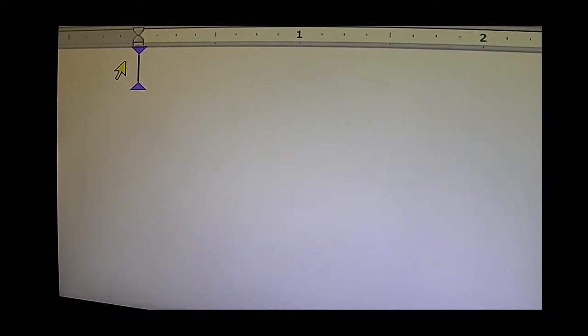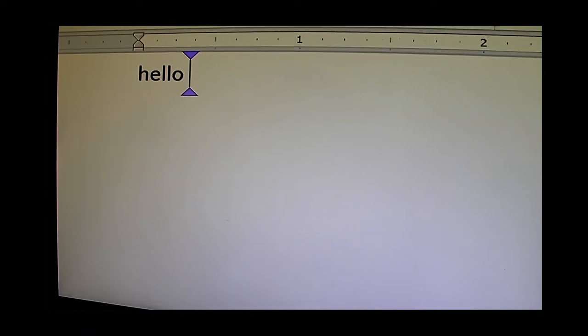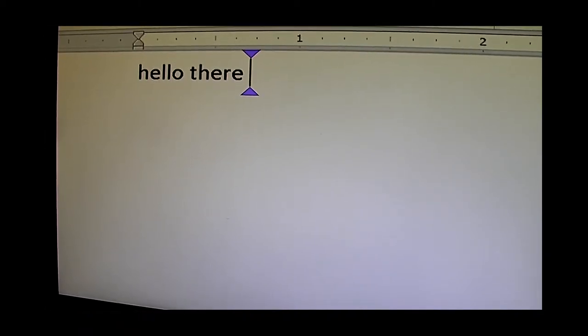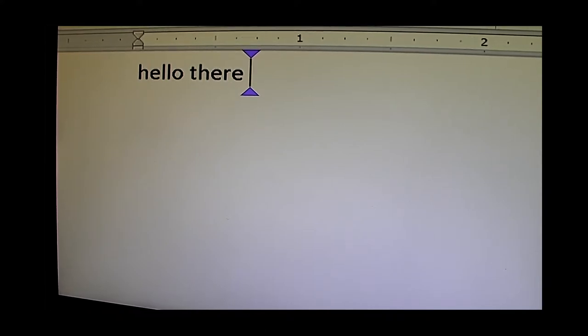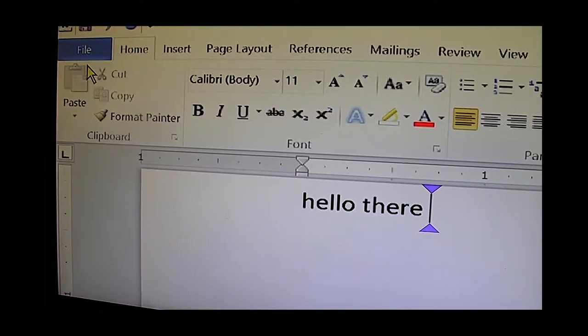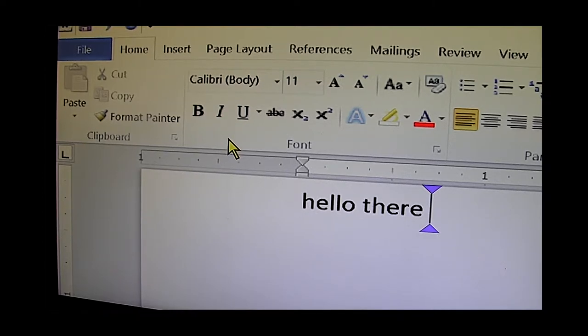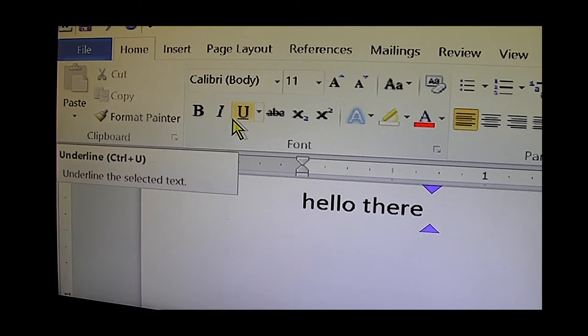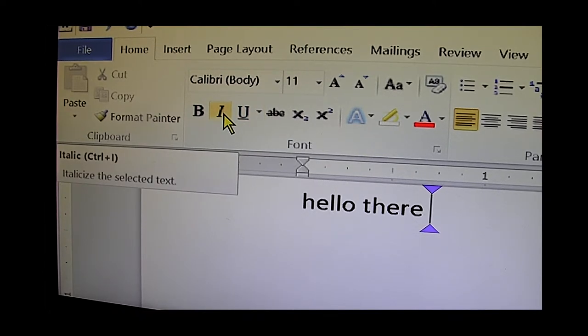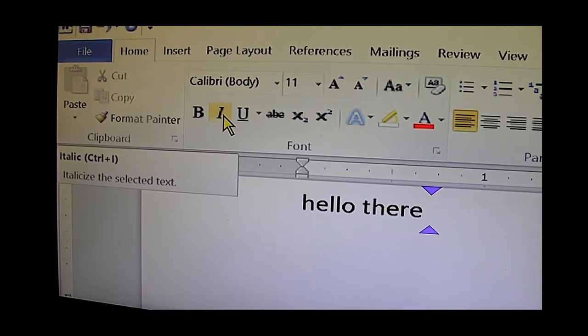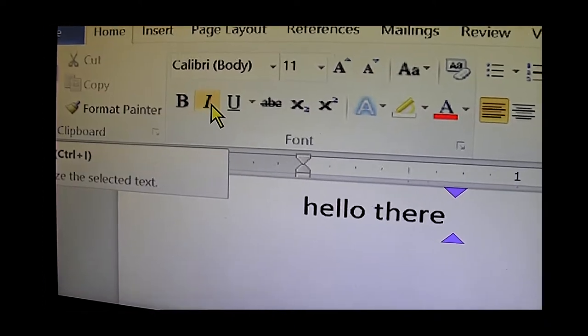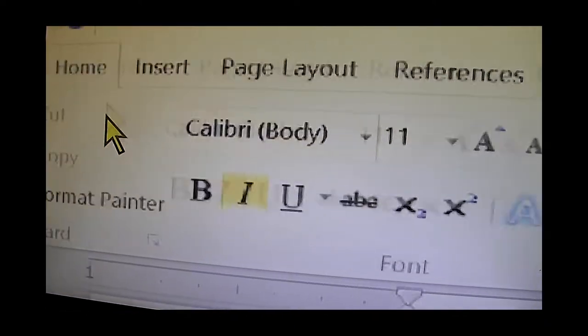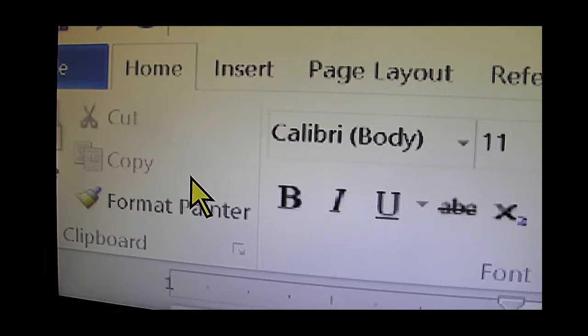I'm going to just type now and you may be thinking well of course I could have just increased the font size in Word to achieve that effect. The real benefit is not so much in the typing, it's in the ribbons at the top. So here now these ribbons are all magnified and spoken. So as I point to the particular controller, the JAWS will be speaking with the speech reinforcing the meaning of the button. We can continue to magnify so that we can actually see this as well.